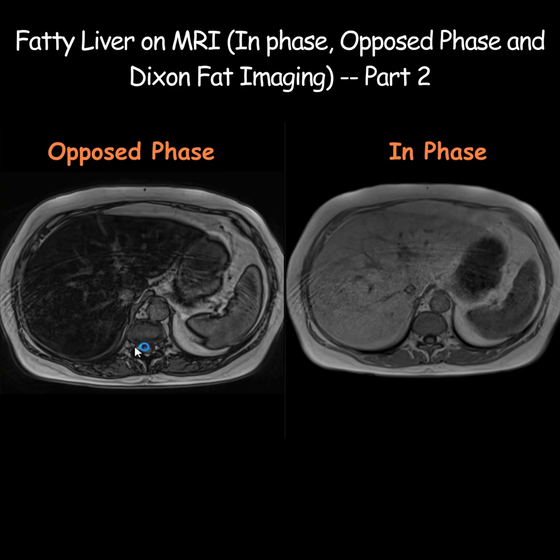Focus on the liver — compare its signal intensity on in-phase imaging with that of the spleen. On in-phase imaging, the liver appears brighter than the spleen. But when you compare it with the opposed-phase imaging, this pattern is reversed: the spleen actually appears brighter than the liver.